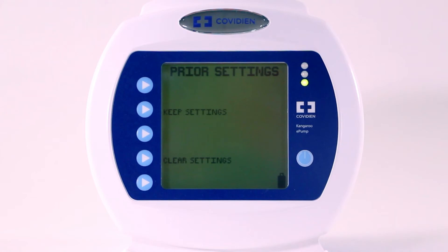You have the option to either keep your previous settings or clear settings. The keep settings option will allow you to keep your previously programmed settings. The clear settings option will clear your previous settings and the volume fed from your previous feeding.